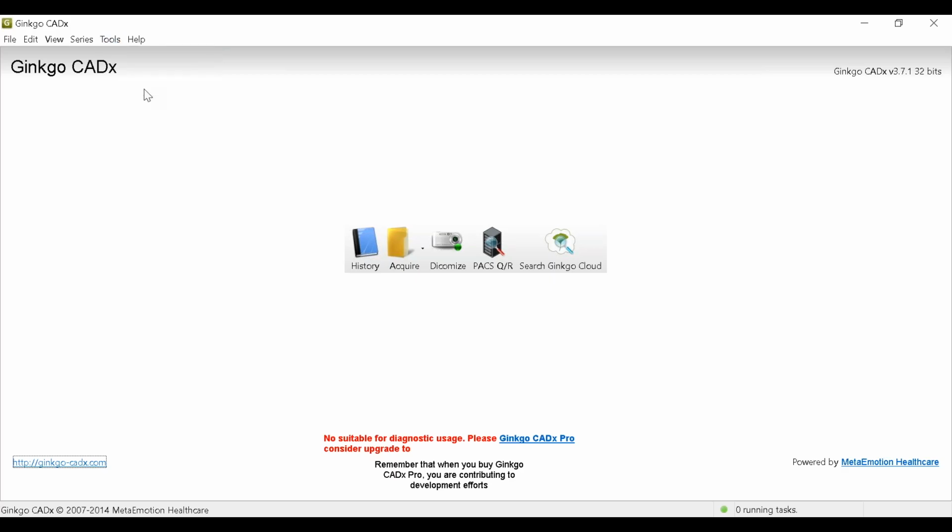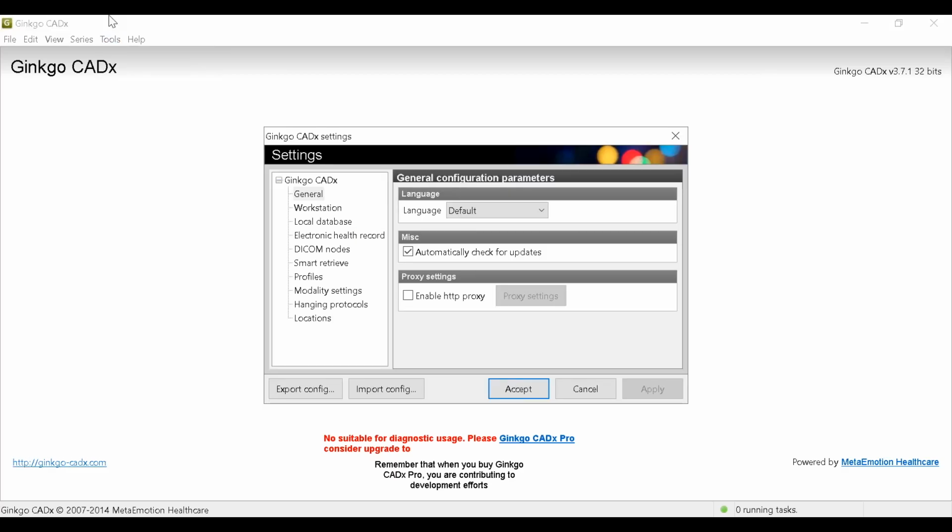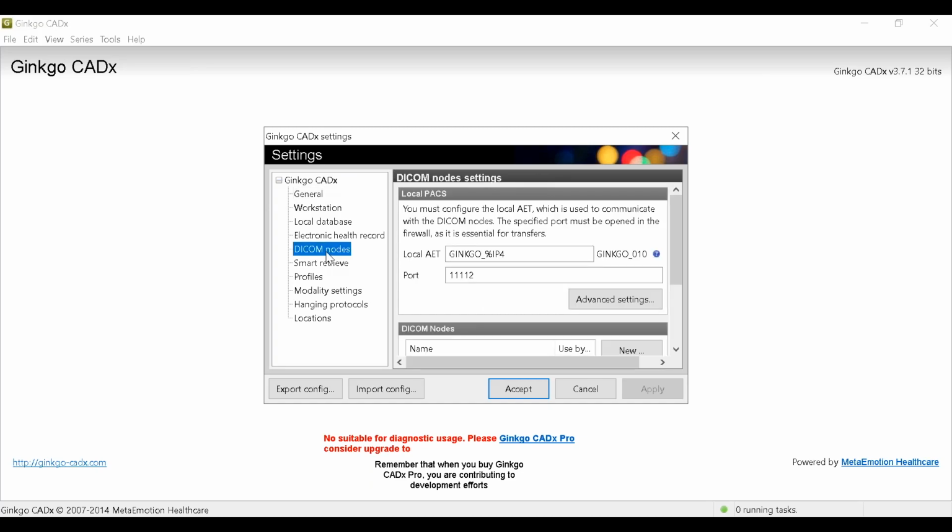Let's go ahead and click on Settings. Now, if you'll notice here, there's something called DICOM nodes. Now, a node is essentially a server. Let's just keep it simple. Node is just a fancy way of saying I've got a server, but node became a term when we started moving our servers off of our local area network and started putting them on the web. And once they became things on the web, server wasn't really the best way to describe it. So they evolved the term to node, but there you go.